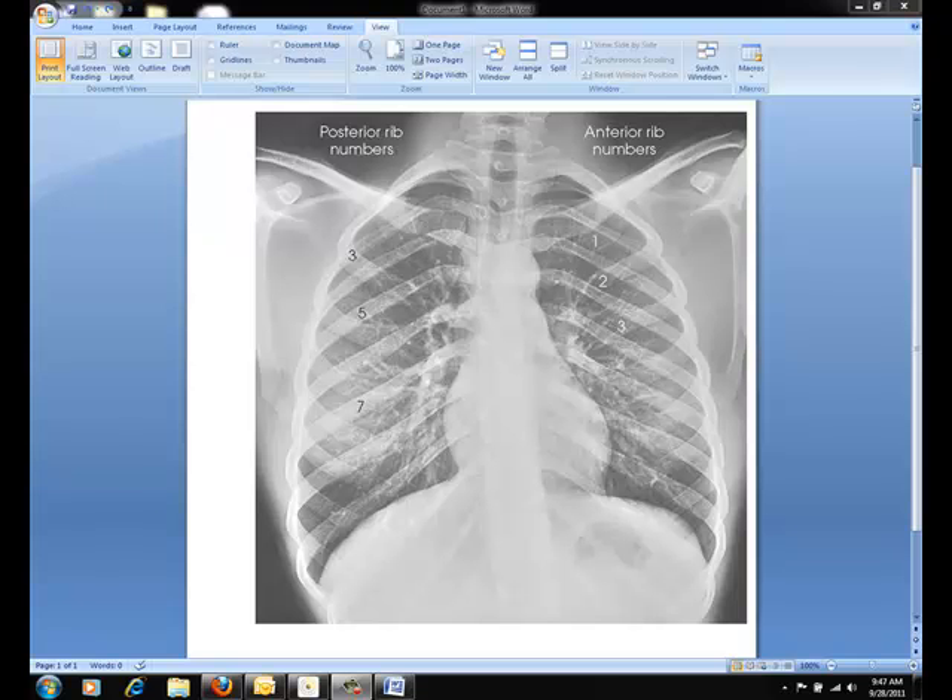Be sure to shield the gonads. For the respiration phase of the upper portion of the ribs, you always want to do second inspiration. Inspiration is the key because it will drop the diaphragm as low as possible.